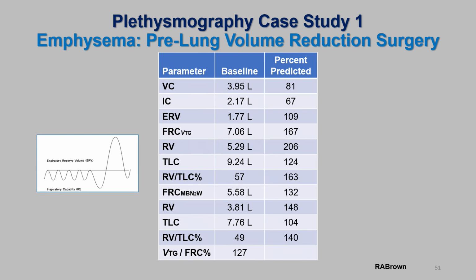This is the same subject I've previously reviewed, a 62-year-old male, 72 inches, 160 pounds. Baseline static lung volume measurements illustrate how lung volumes may be underestimated if only multiple breath nitrogen washout methods are used. The TLC fell within the broad range of normal with the multiple breath nitrogen washout test but was elevated when measured via plethysmograph.